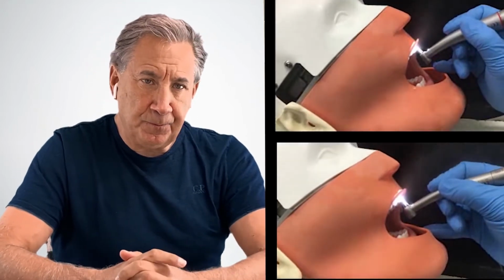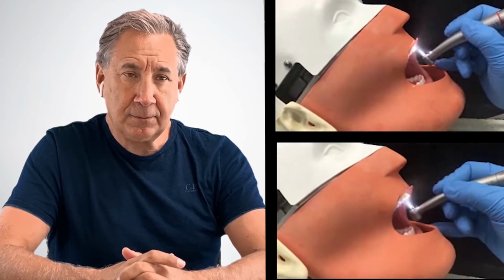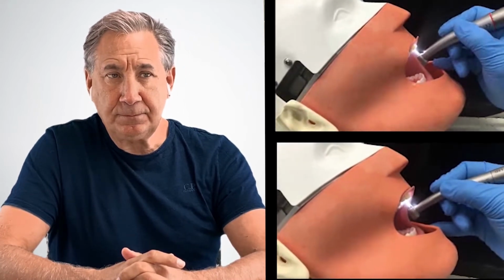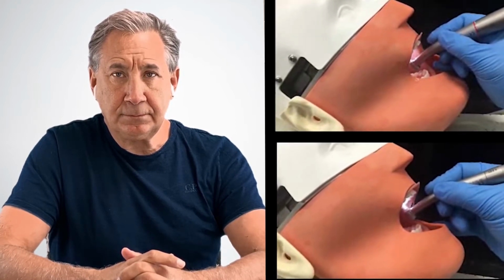All right. So, as you said, high and low speed handpieces, when they're used in a patient's mouth, may come in contact with blood and saliva. That makes them subject to contamination. The thing is that when you're dealing with water and high speed air-driven handpieces, things get even more serious. Just think about it. When you press the foot pedal, there's a flow behind the handpiece. And that's fine. The moment you release the foot pedal, you try to stop the rotation of the burr, but due to the nature of the turbine, the propeller keeps rotating for a minimum of a second or two.